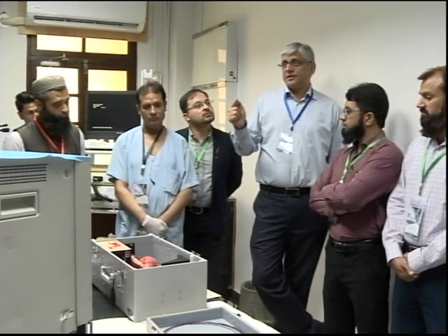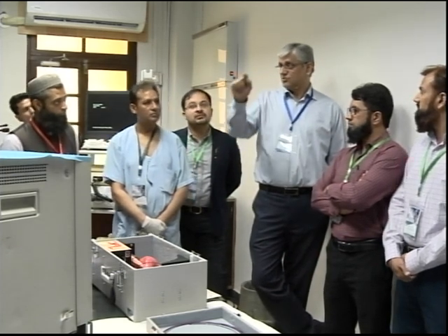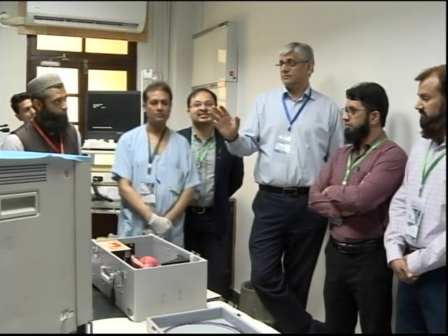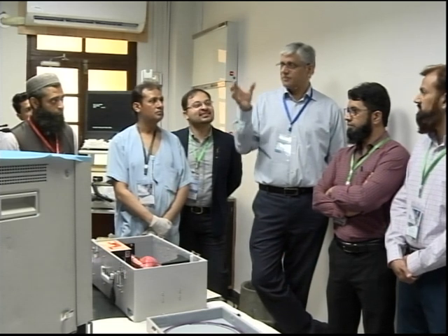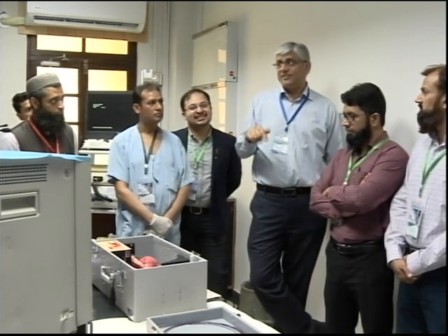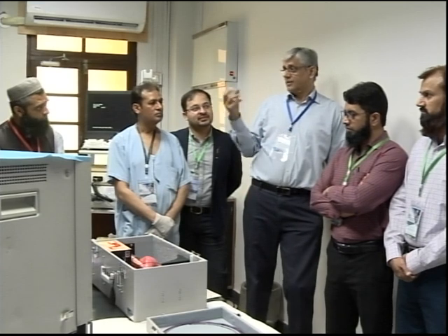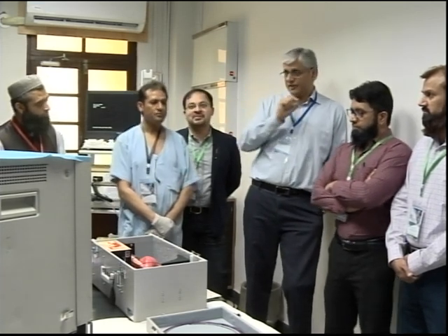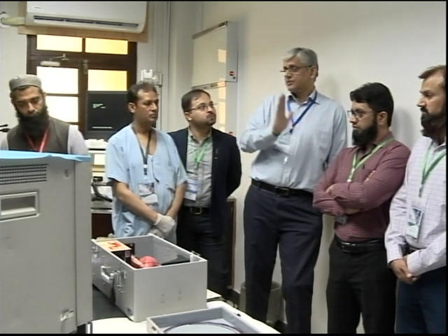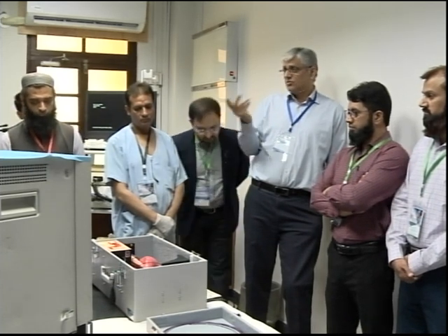Number two, you must remember that when you have actually played with the ampulla, the same ampulla that these two would have gotten with almost their eyes closed, now is a swollen, edematous, difficult ampulla. So every case we get, not every, but some at least significant number of cases that we get after our juniors have actually played with the ampulla are actually difficult ERCPs. Now for us, it may appear easy because of the experience people have, but it's actually the swollen edematous papilla that you don't like, because you've actually prodded and tried and kept on trying. So I think before you mess it up for your boss, it's important for us and for you to realize, look, this is time I stop, because I'm not making headway. And you'd know it straight.